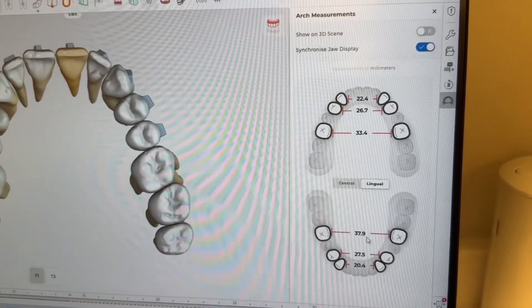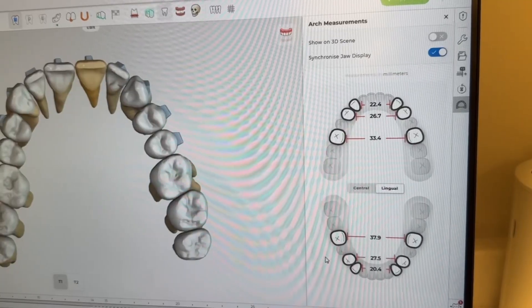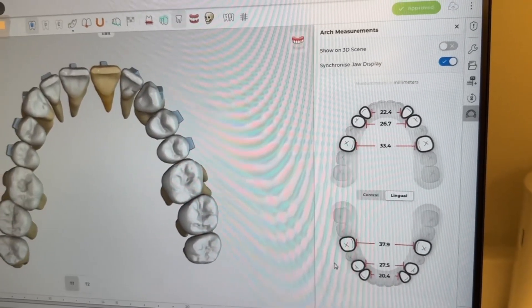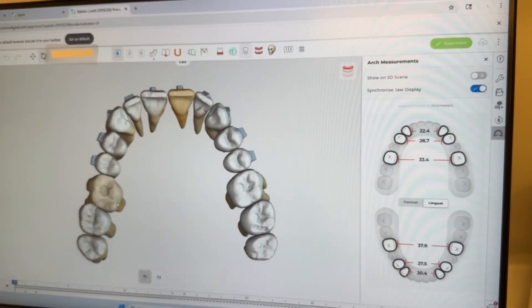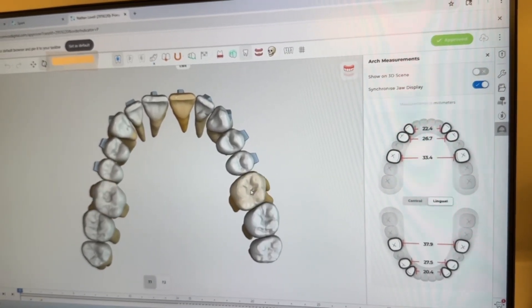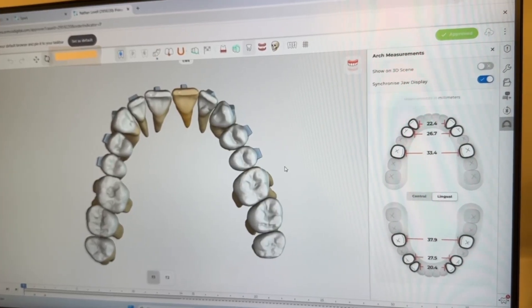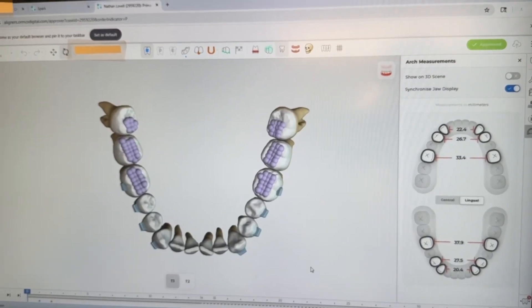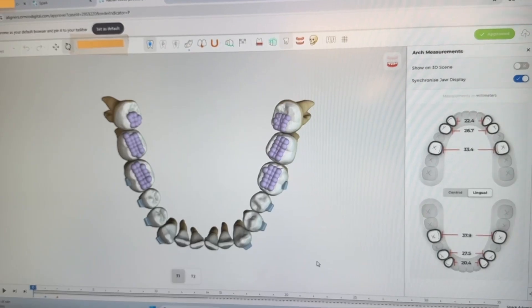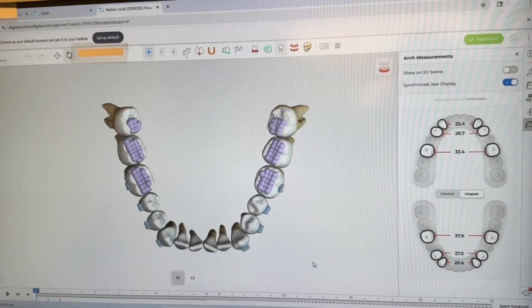He has a larger bottom jaw. He has almost a 38 millimeter intramolar width on the bottom — specifically 37.9 millimeters. And what we obviously want to do is expand the upper arch by a lot. Here's a good close-up view of the lower arch showing that 37.9 millimeter intramolar width.